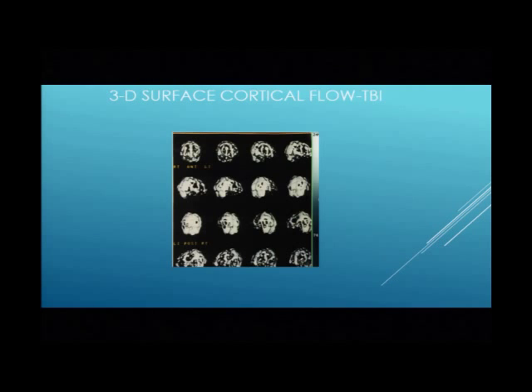It keeps rotating around and around. There you go, the back. You look at the back. Most of it's white. But if you look carefully, you've got 3 or 4 spots here, and you've got 1 there. And it clearly shows that it's worse on the left than the right. And clearly shows it's worse in the front than the back. And when we see a pattern like that, a difference from left to right and front to back, that's highly characteristic of a trauma, concussion.